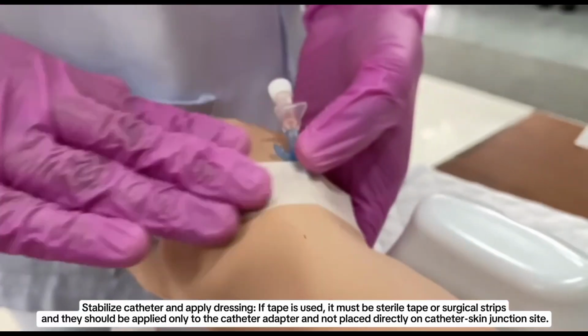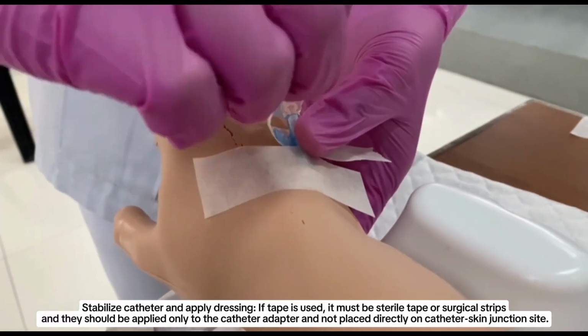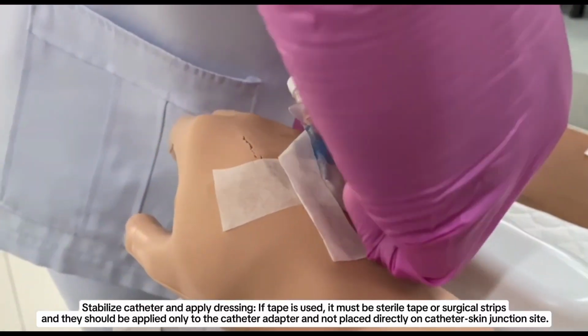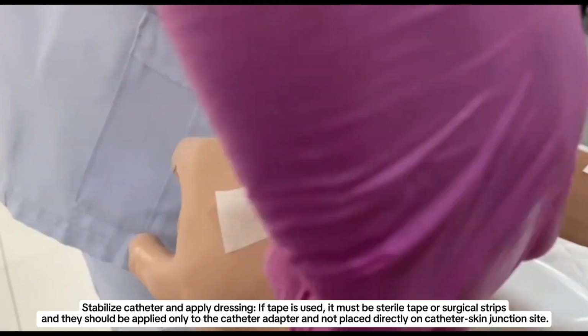Stabilize the catheter and apply dressing. If tape is used, it must be sterile tape or surgical strips, and they should be applied only to the catheter adapter and not placed directly on the catheter skin junction site.